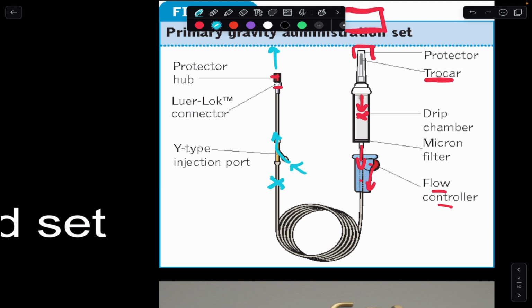medication through afterwards. Most commonly, you're going to see a flush after you push medication through. So say that you just push medication through, but the medication could be sitting in this portion of the tubing. So then afterwards, you would take a 5 or 10 cc saline flush and you would push it through afterwards to push this all the way into the patient.